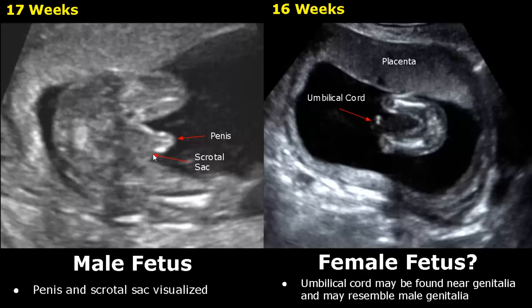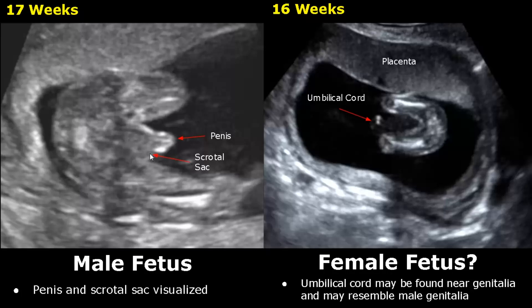Here we have a male fetus at 17 weeks. It is a transverse view of the perineal region. We can see the penis and a small scrotal sac between the thighs. These are the thighs. This dome-shaped structure is the scrotal sac.